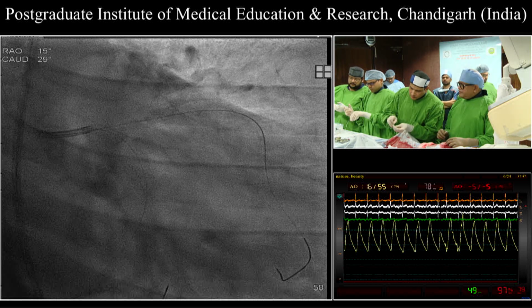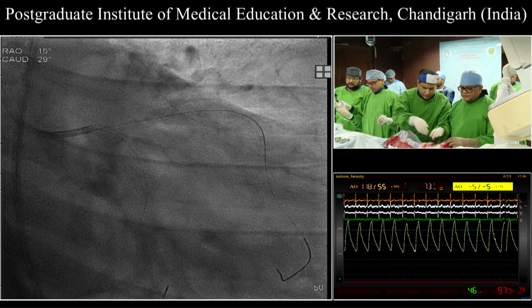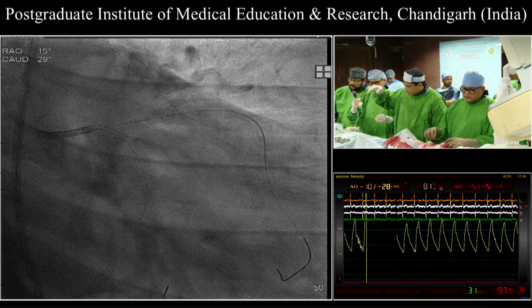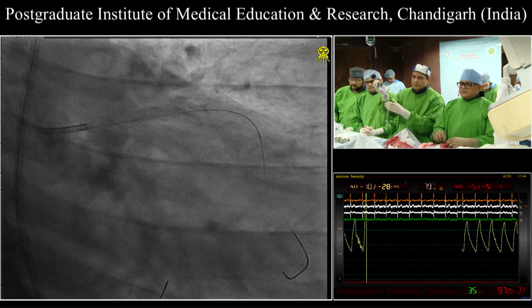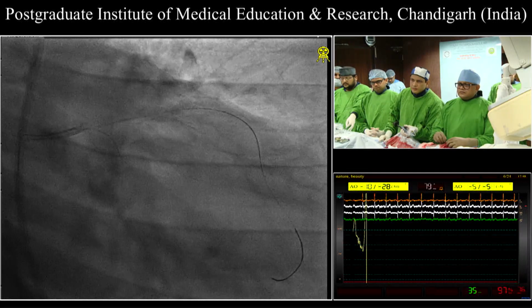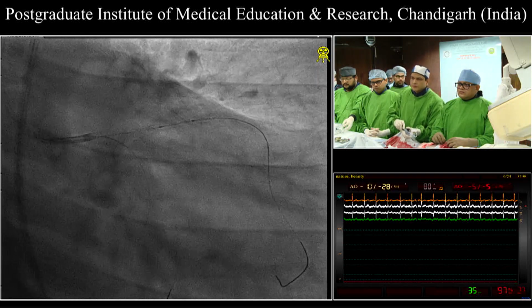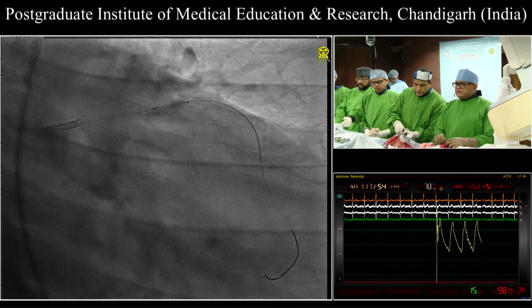So better preparation of the ostium and then cutting balloon. That's right. But for the panel, what scientific information do we have about treatment of stenosis in the proximal LAD? I think what we have is stenting. Any comment about that?